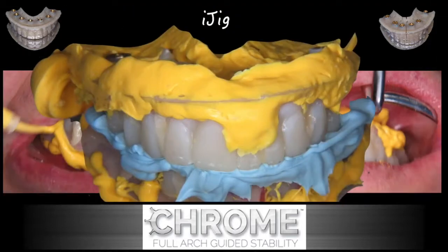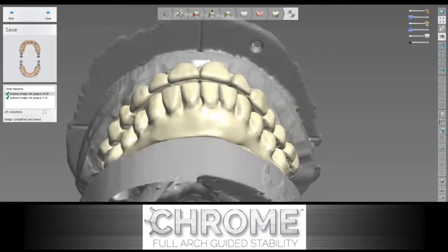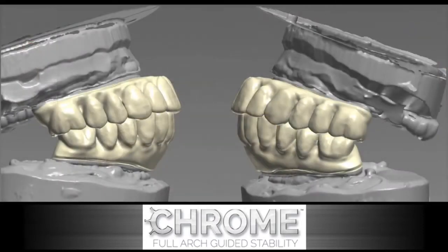A bite registration is absolutely essential to ensure the proper bite relationship between the mandible and the maxilla, whether we're doing dual arch or single arch. This information will get translated into whatever software the laboratory is using. In this case, you can see this is 3Shape, and you can see the bite relationship that has been established in the different views.